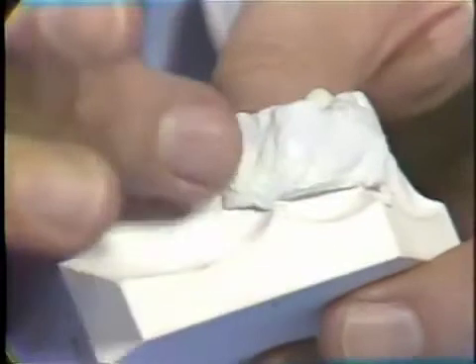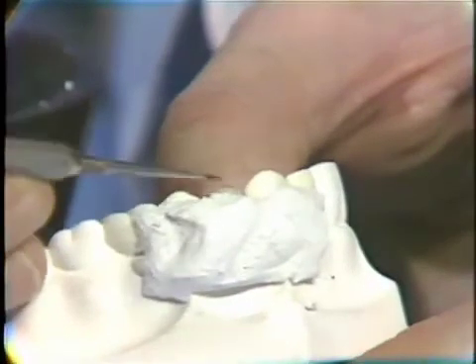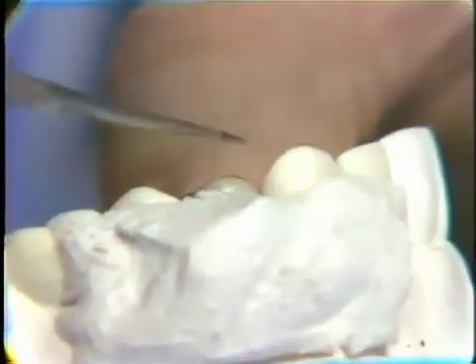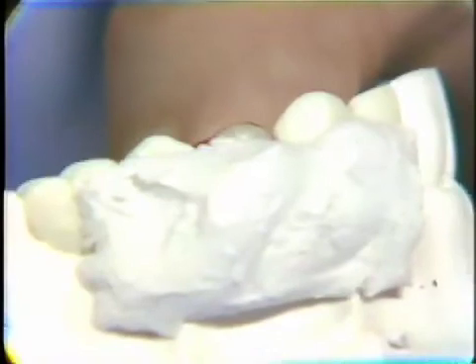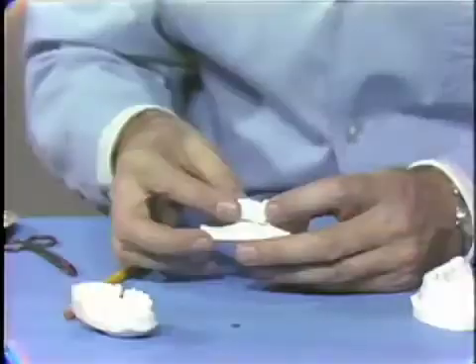It wants to go onto at least one tooth on either side, and preferably two, and down onto the mucosal areas, as you can see. Moisten the finger. At this stage, you can just adapt the plaster to wherever you want. Notice that it stops short of the occlusal boundary of this pontic here. You want to be able to get at that to wax it. You're going to do the occlusal waxing with this template in position, so you don't carry it up over that boundary. If you do, of course, you can always trim it back later on when the plaster has set.